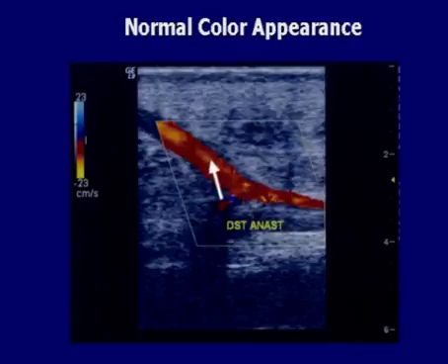It illustrates normal color filling right out to the edges of the wall, but it also illustrates something else, in that most of the time the bypasses are performed with the end of the bypass sewed to the side of the artery. So it's an end to side anastomosis. And that's done because sometimes we see a little bit of retrograde filling back up the native vessel, which may go out small secondary branches and collaterals. So usually that's the appearance of a bypass anastomosis.